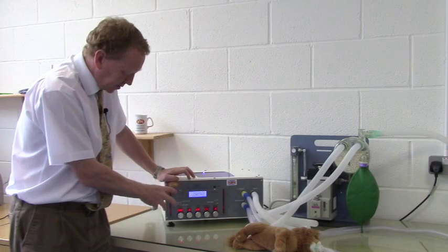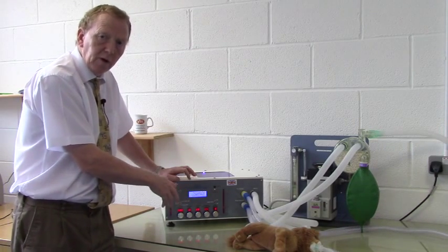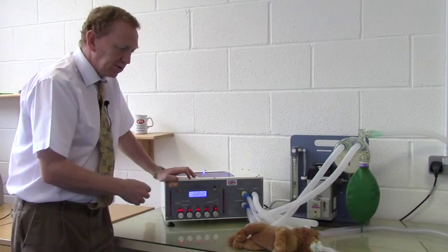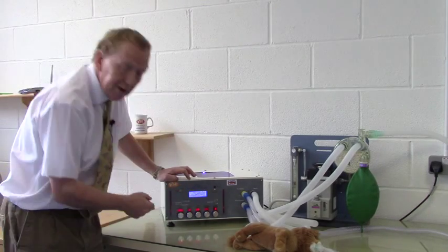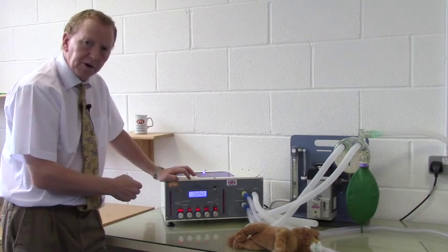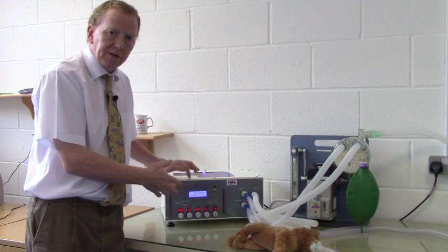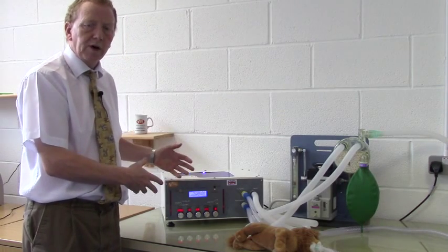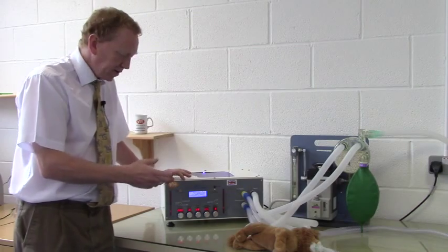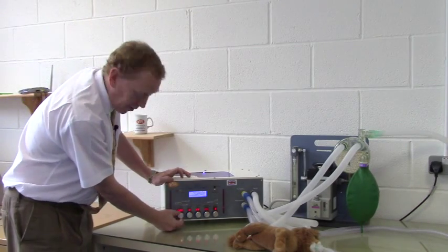So we've set our tidal volume, our inspiratory time, and our expiratory time, which dictates our respiratory rate. The animal is now ventilating at a rate of 15 breaths a minute with a maximum inspiratory pressure of 18 centimetres. Now, in practice, if this was 18 centimetres and this was a normal healthy dog, I would consider that to be slightly excessive. To initially reduce that, I would simply reduce the tidal volume.